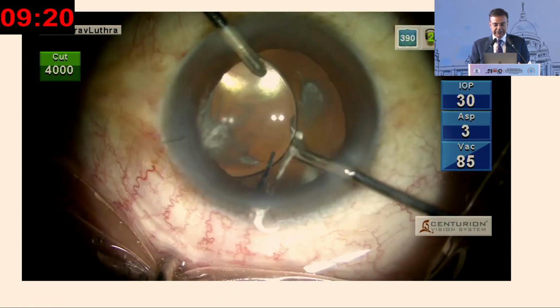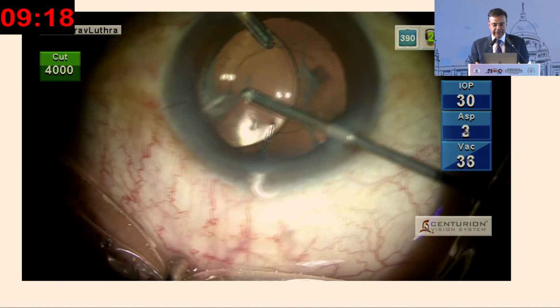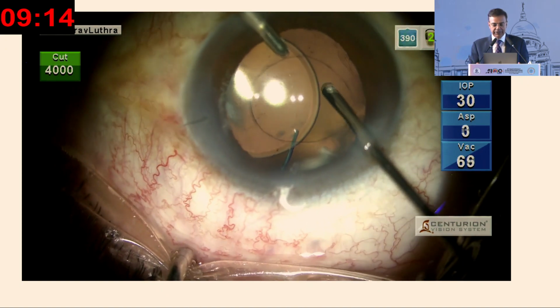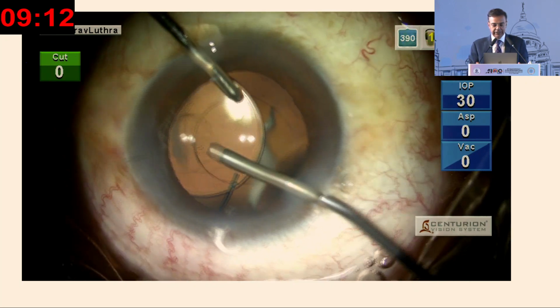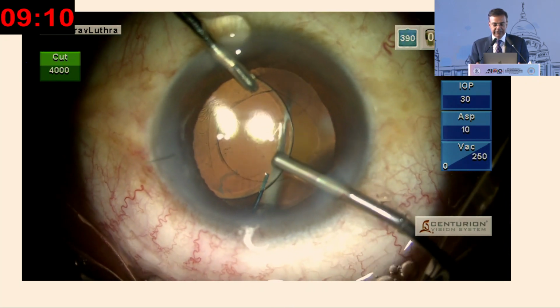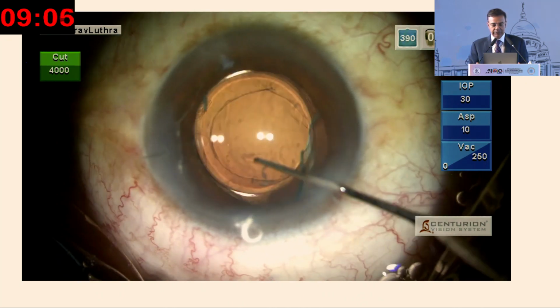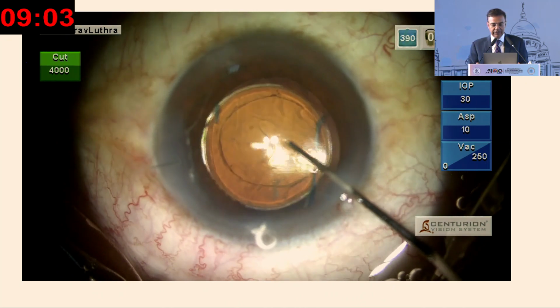We could see a big PC rent visible to the side where the IOL had dislocated. And there can always be vitreous which may be present, so one has to be very careful checking it. If you have vitreous, the first thing you have to do is make sure you've cleared all the vitreous out from the anterior chamber and from whatever is surrounding the lens.